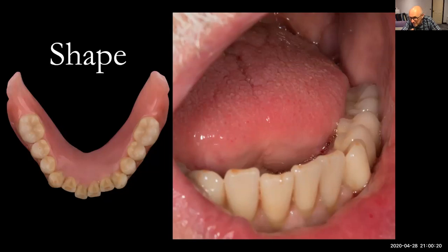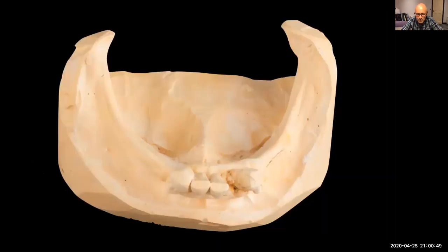This is Bert's denture, by the way. This is the actual denture of Bert. And in his mouth, if you look on the right-hand side, the way that denture fits so beautifully, the tongue sits on it. We've got a great buccal tongue contact position, BTC, as Dr. Arbe calls it here. Superb. And then we've got the retromolar pad coverage just there, and the cheek and the tongue sitting there. It's fantastic. It works really well.